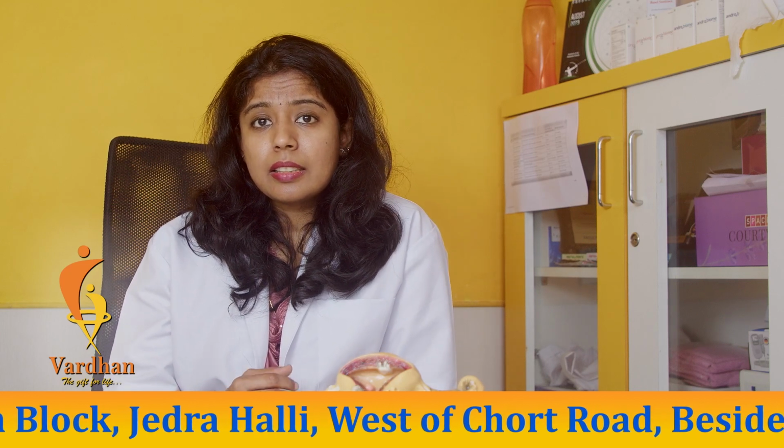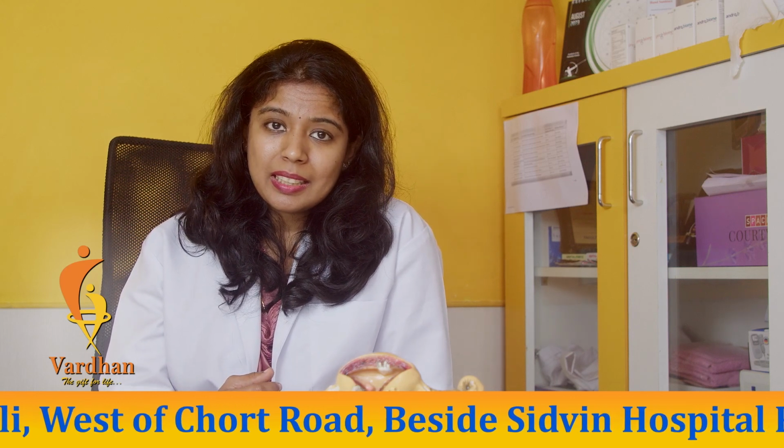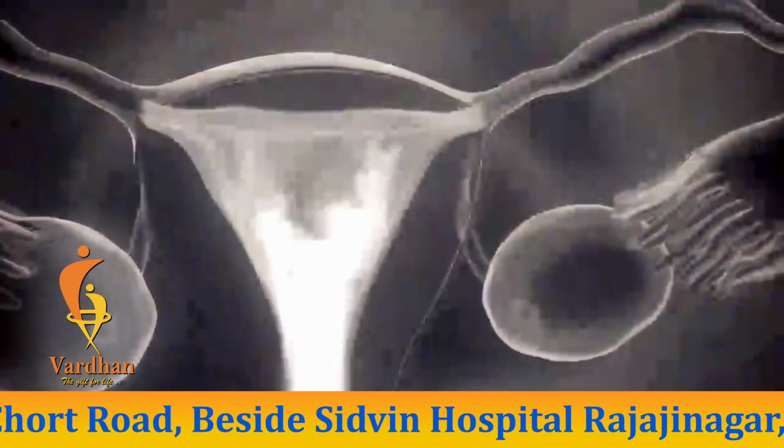And in case you are very anxious and you feel very scared and afraid of the pain, then this procedure can also be done under sedation in very few patients. It depends on the patient's comfort level.